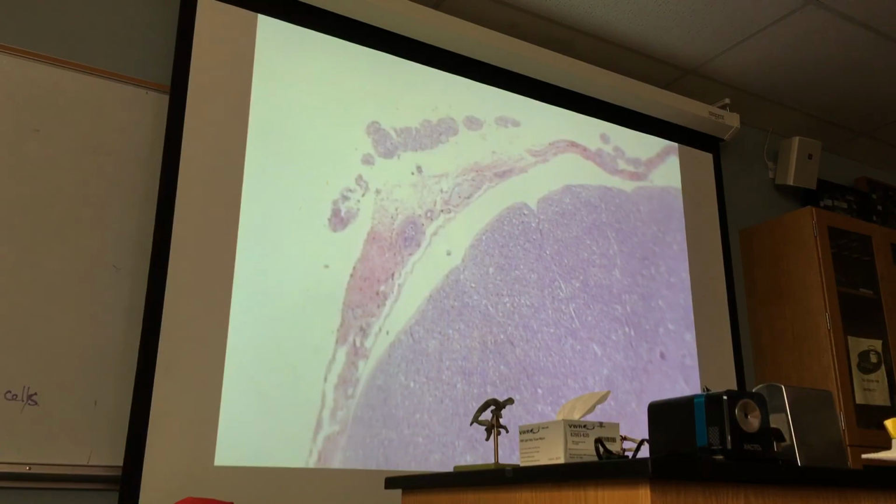You know, in your professional life, you see so many head injury or spinal cord injury cases, and when they are sent to the emergency room and also for radiological study, there will be blood clot here, if there is bleeding. That's the subdural space. And this is dura mater, and below is the subarachnoid space, and you can see the pia mater, this thin layer.